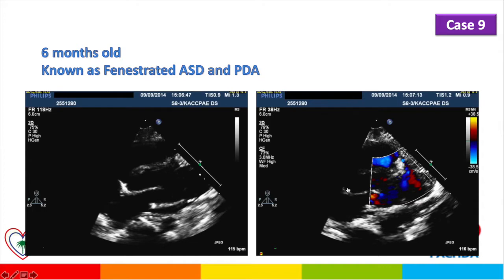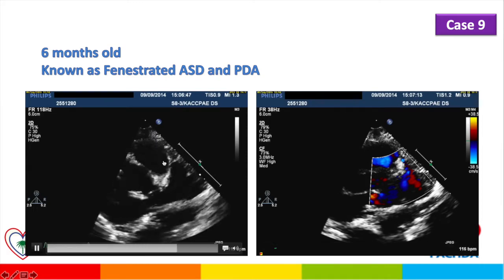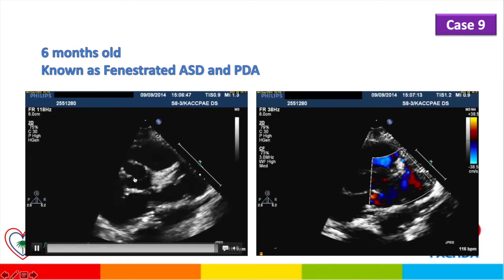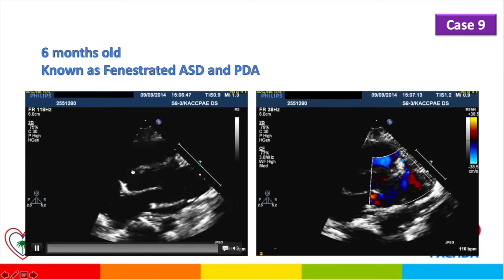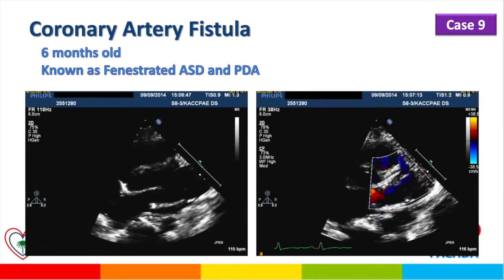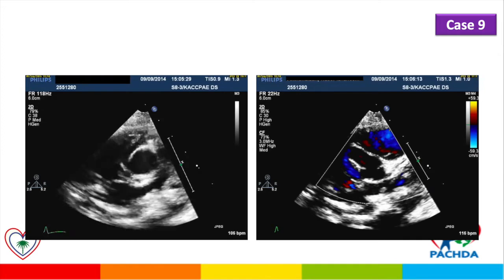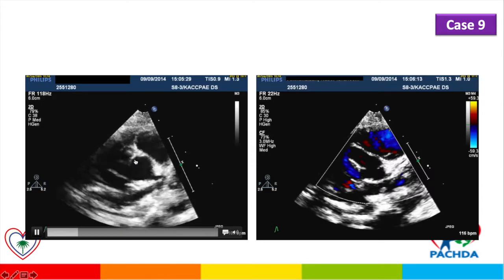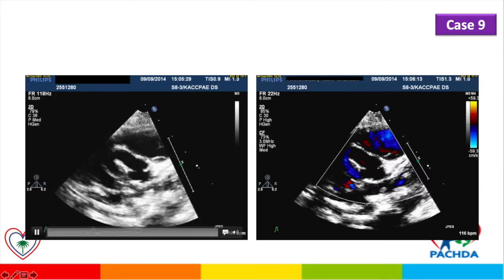This is a 6-month-old with a known fenestrated atrial septal defect coming for follow-up. The aorta and left coronary artery appear normal in size and caliber, but on careful inspection there is a dilated origin of the right coronary artery. Here, in cross section, the proximal part of the right coronary artery is seen to be significantly dilated.